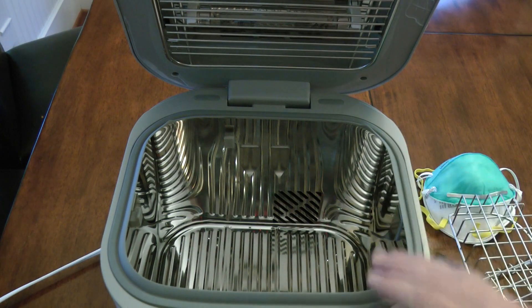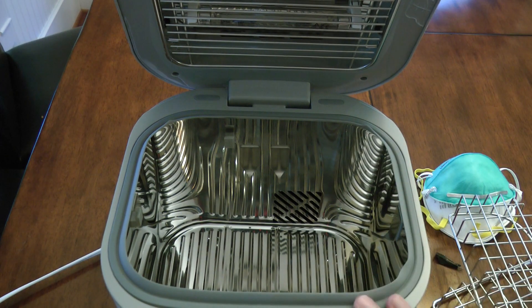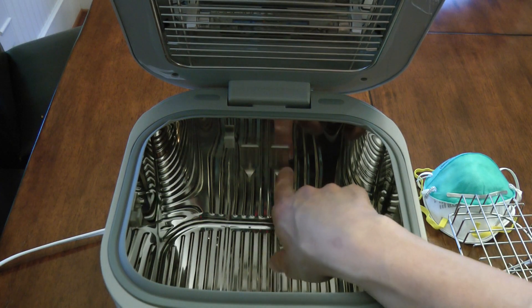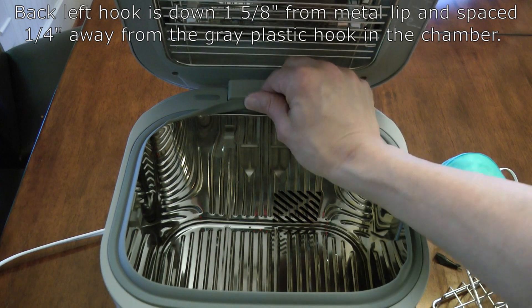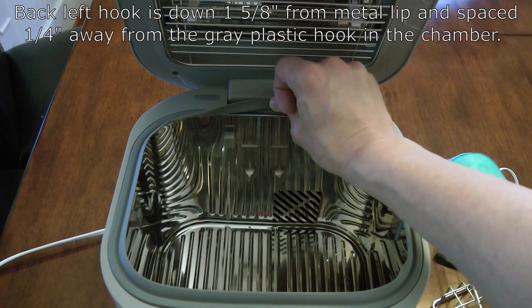I'll show you the location where all these hooks go so you can go ahead and put them in your Coral UV Sanitizer for the purpose of decontaminating N95 respirators. Let's start with the back wall. There are two hooks on the back wall and they're down one and five-eighths inches. If you fold up the little rubber at the top and measure from the lip of that metal down to the top of the hook, it's about one and five-eighths inches.